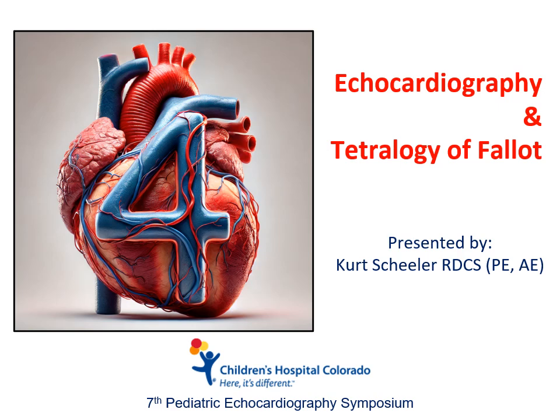I'm one of the pediatric cardiac sonographers here at Children's Hospital Colorado, and today I'm going to be discussing how to image Tetralogy of Fallot.